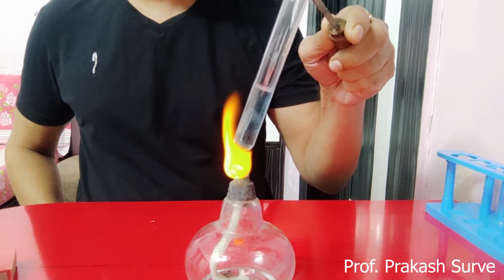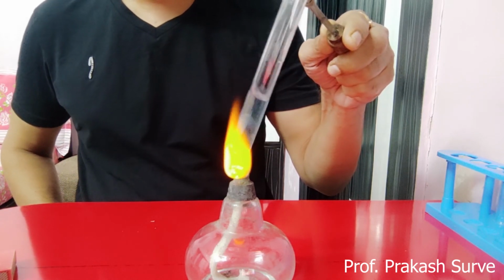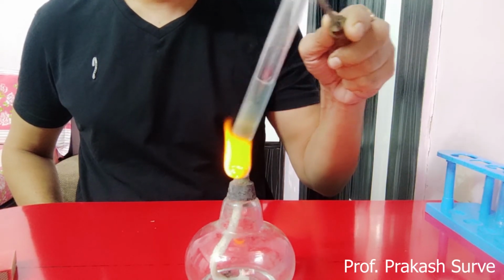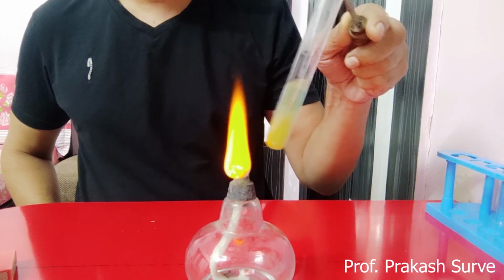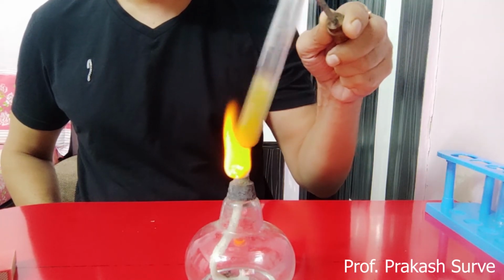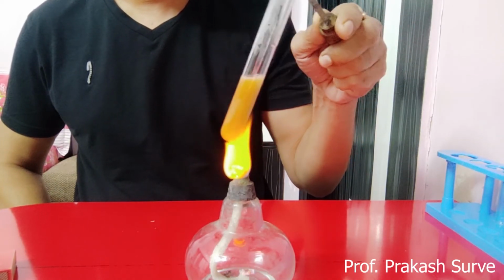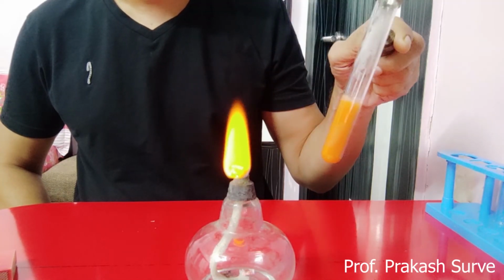Now suppose the color of this mixture remains blue, then it indicates that sugar is absent, glucose is absent. And suppose this color changes to yellow, then it indicates that it is having 0.5% of glucose, and suppose it changed to orange color, then it indicates 1% of glucose.